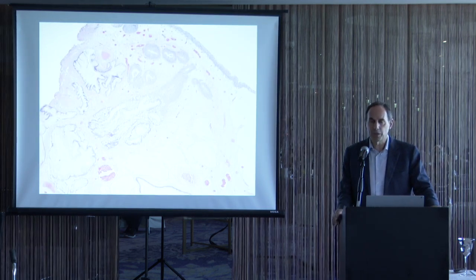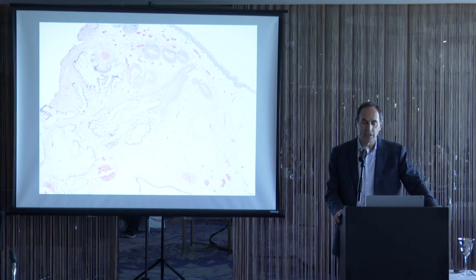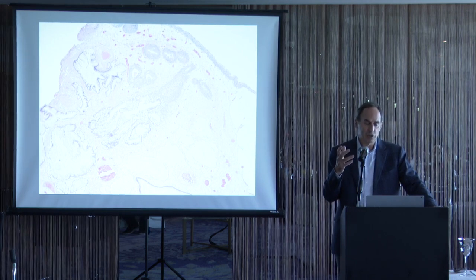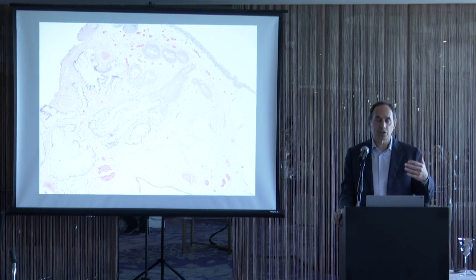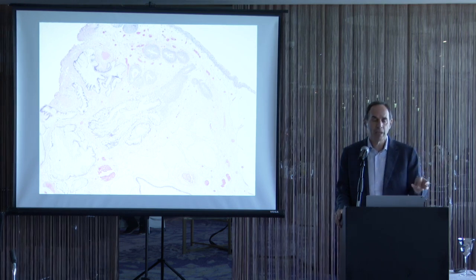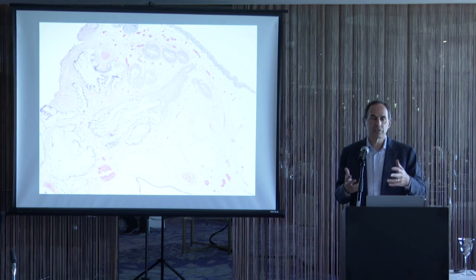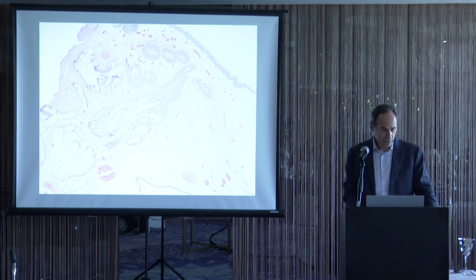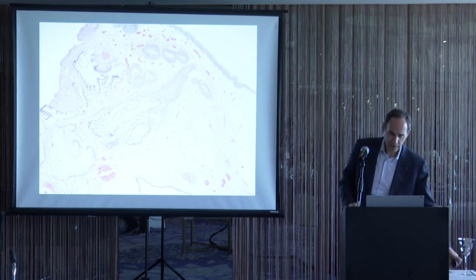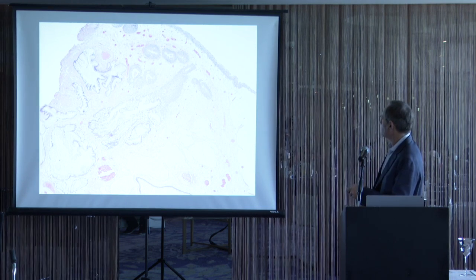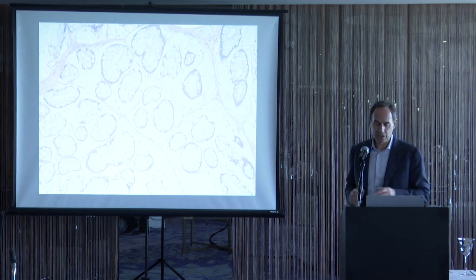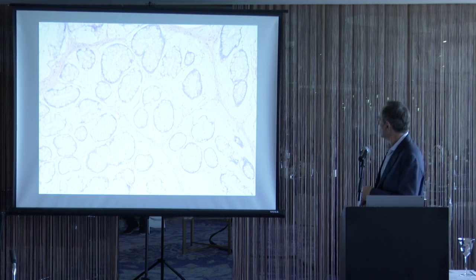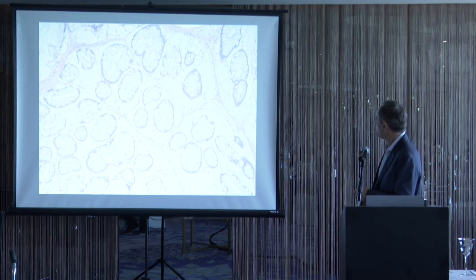Florid intestinal metaplasia can make a tumor-like mass at cystoscopy and imaging. Clinicians may push back when you sign something out as florid intestinal metaplasia. You can see a transition between cystitis glandularis and intestinal-type metaplasia. Note the extracellular mucin — it's acellular. The glands floating in mucin have very bland cytology: nuclei basally located with abundant goblet cells.